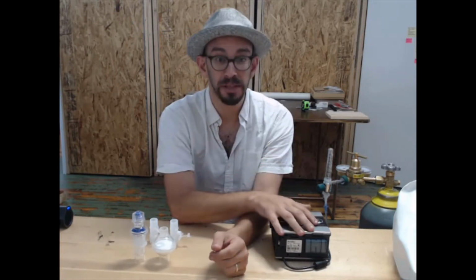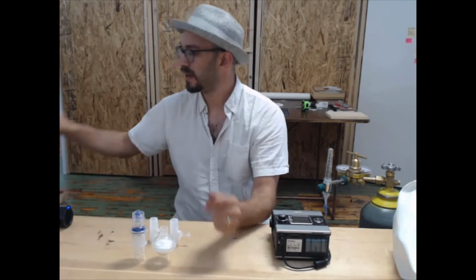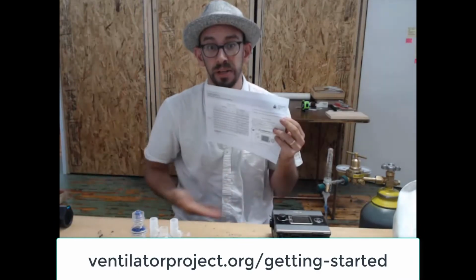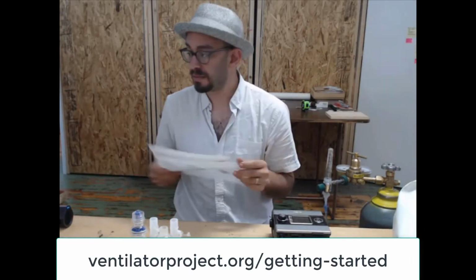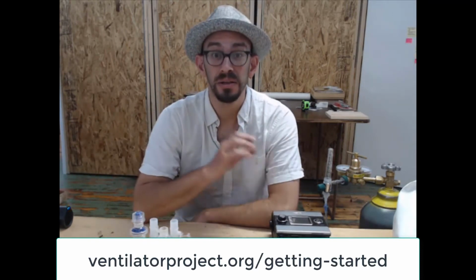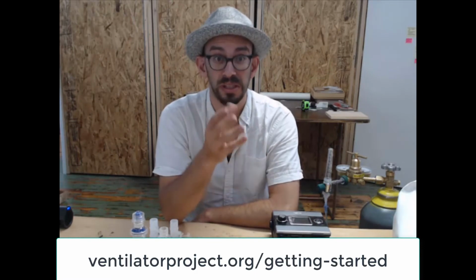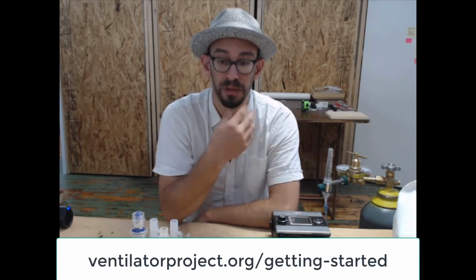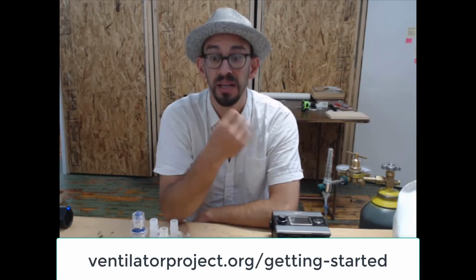To learn more about how to get started with your CPAP machine, if you look on the back side of this, there's a Getting Started guide, or you can look below at ventilatorproject.org/getting started. And go to that guide. You can find your model of CPAP, and there are video tutorials showing how to get into its settings, how to plug it in, how to get started for the very first time, and how to adjust pressure settings on that machine.